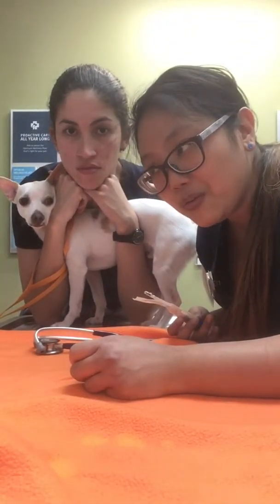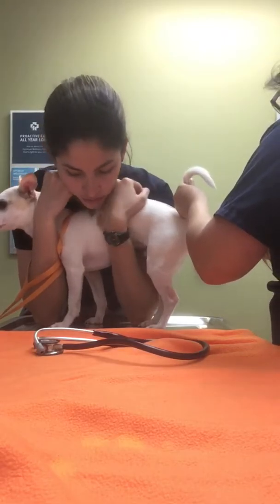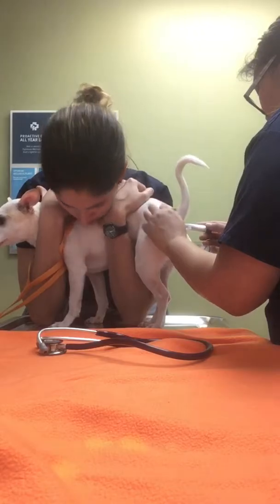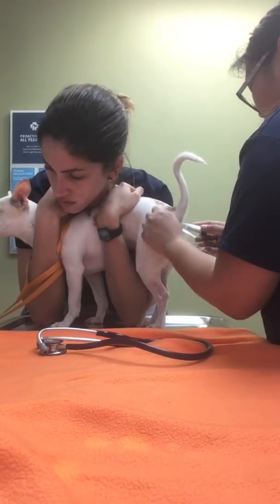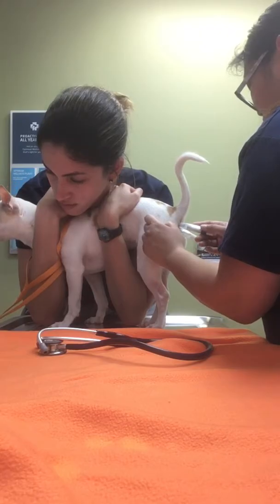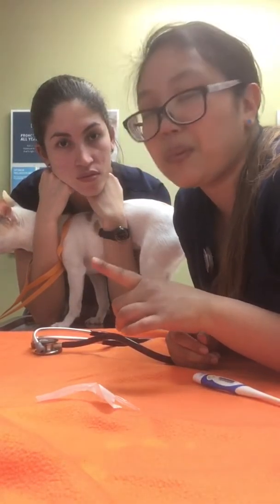Typically, we're supposed to pay attention the first time, but this time I didn't, so I'm going to repeat the temperature just so I have it correct. Oh, I'm sorry. I'm so sorry, Gizzy. I'm so sorry, Gizmo. I know, I'm so mean. 102.5. Once again, we only do the temperature once. I repeated it because I couldn't remember the first time.